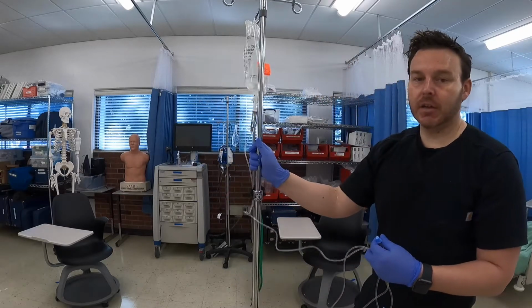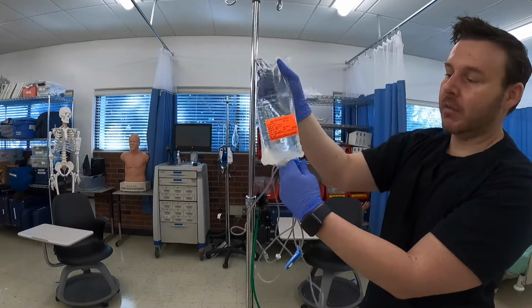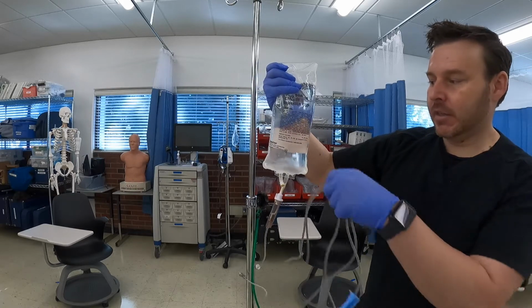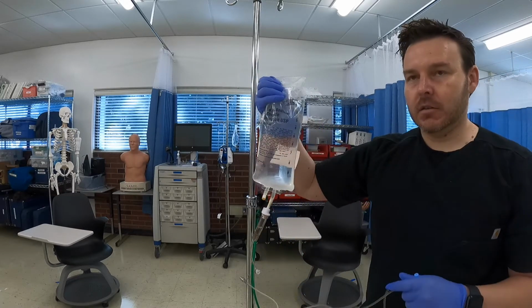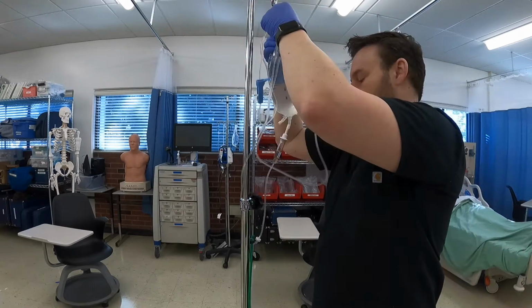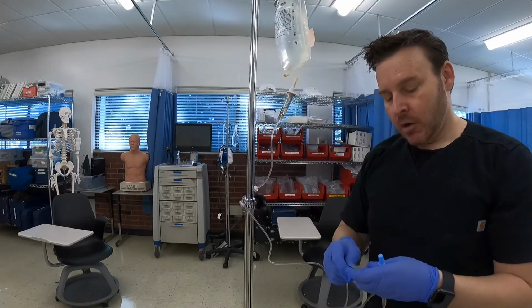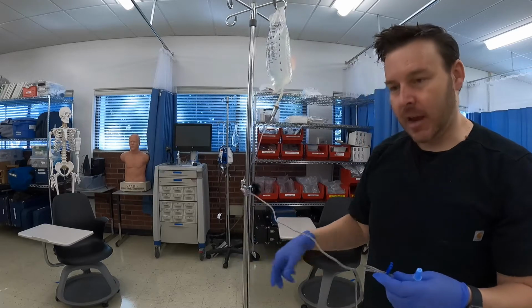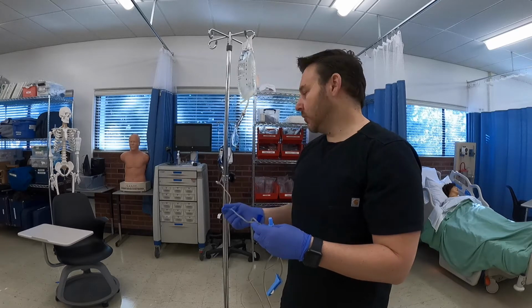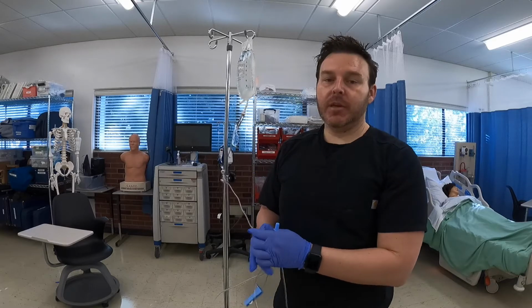As you can see here, I have labeled my IV bag, and you want to label it on the back, because you don't want to label it on the front, because it can hide what the fluid might be. So you want to put it on the back. Once I have done this correctly, now I'm ready to enter the patient's room. But before I do that, I do have to make sure that I put that label on the tubing to make sure we're following our facility protocols. So I'm going to do that, and then I'm going to head into the patient's room.